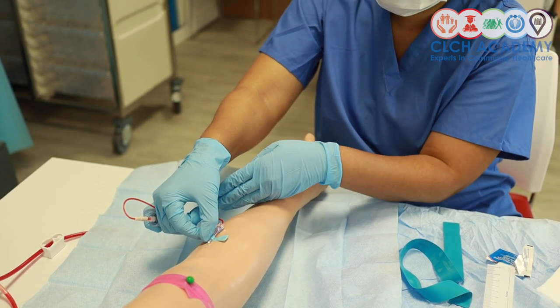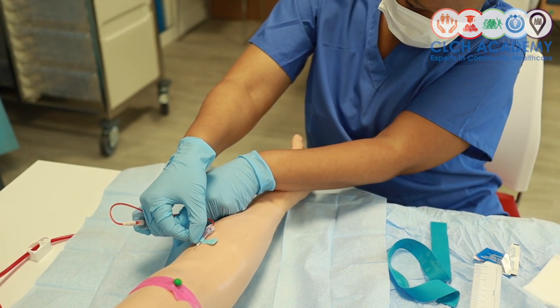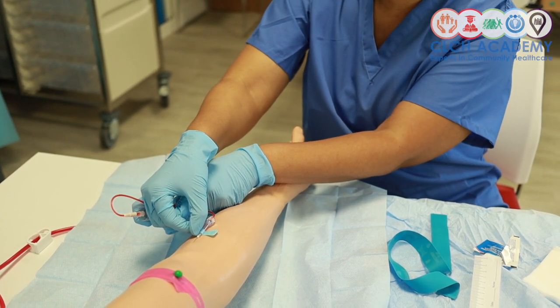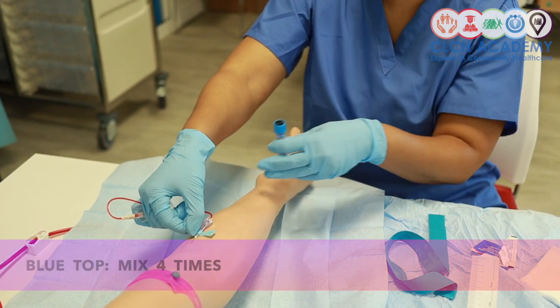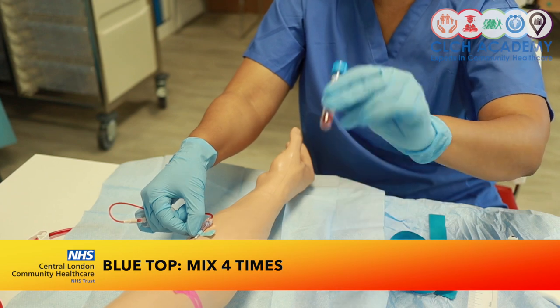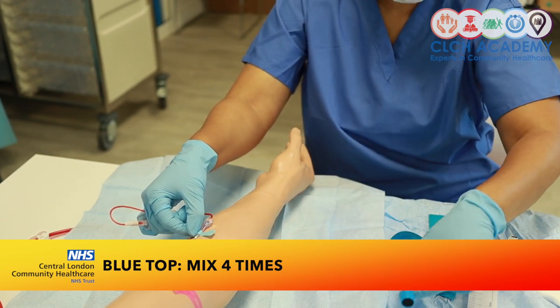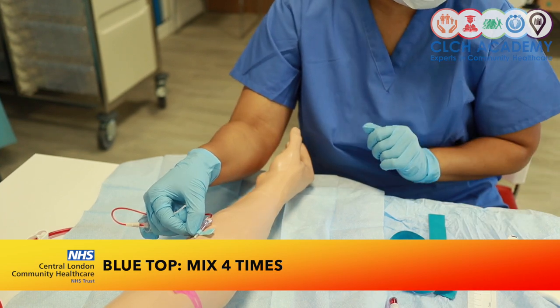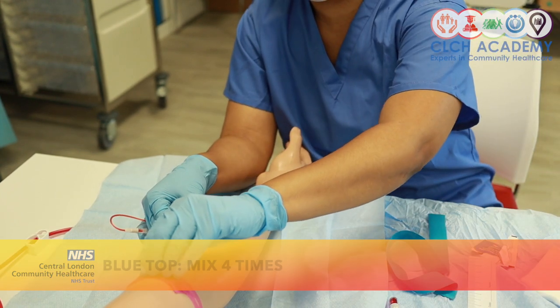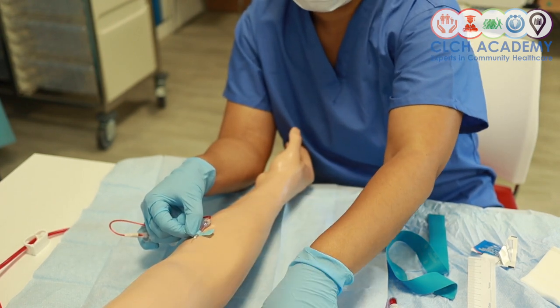I usually position the bottle downwards so that gravity works with me on this one. Once the bottle is sufficiently filled, I'm going to remove that and do my inversions. According to the order of draw, this is for 4 inversions. Right, the next tube that I will be drawing up for today will be for our urea and electrolytes.